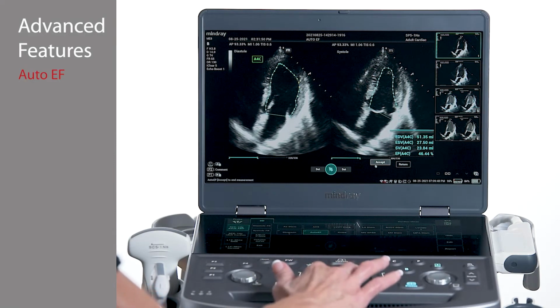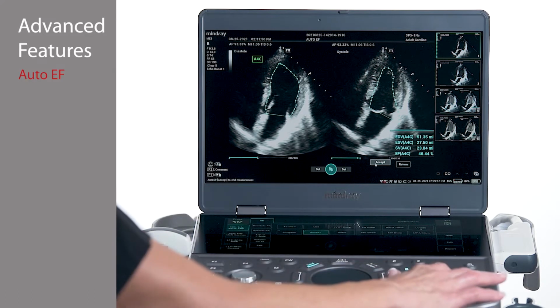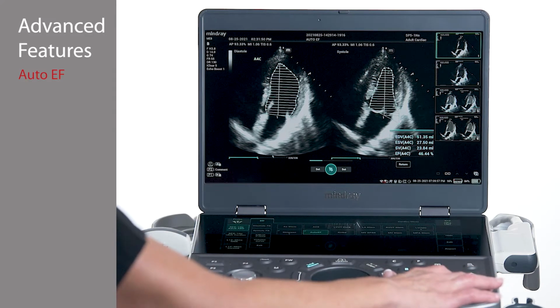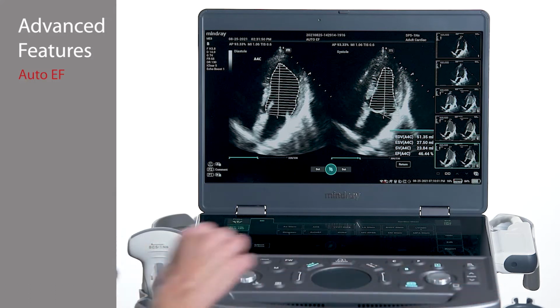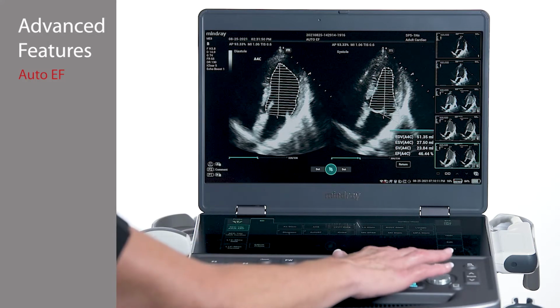Accept results will place data into the report. Finally, there is an Exit tab when finished. Additionally, pressing the Save key will both save an image of the screen and put the data into the report. If desired, repeat the process with the other view. Analysis of both an apical 4 chamber and an apical 2 chamber will yield biplane results.